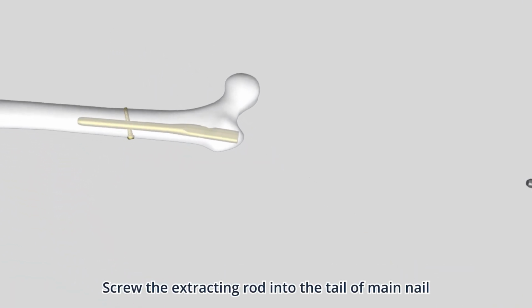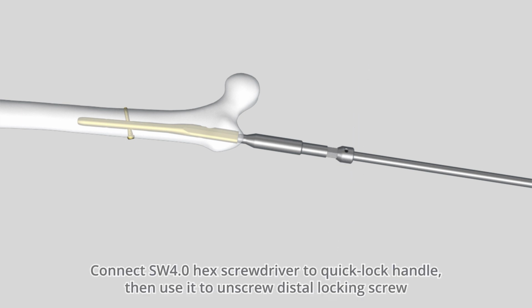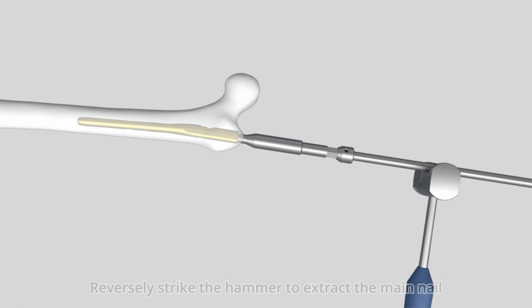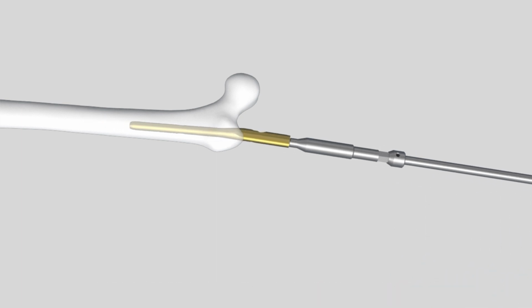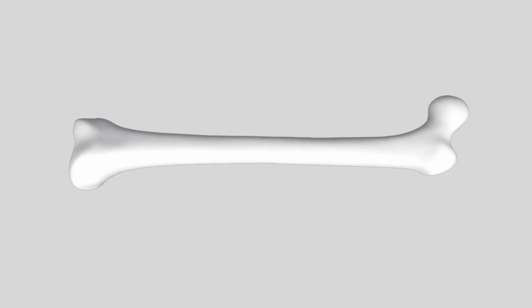Screw the extracting rod into the tail of main nail. Tighten it with a wrench. Connect SW 4.0 hex screwdriver to quick lock handle, then use it to unscrew distal locking screw. Reversely strike the hammer to extract the main nail. Finally, implement a standard suture.